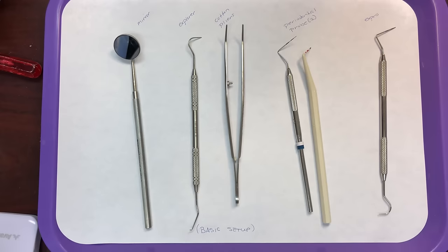Hi everyone, this video is going to go through the variety of dental instruments that you will need to know for your DENA 1340 class. We're going to start out with the basic setup with examination instruments. For this class, you have to be able to recognize the instrument by name, give the use of the instrument, and know what category the instrument belongs to.